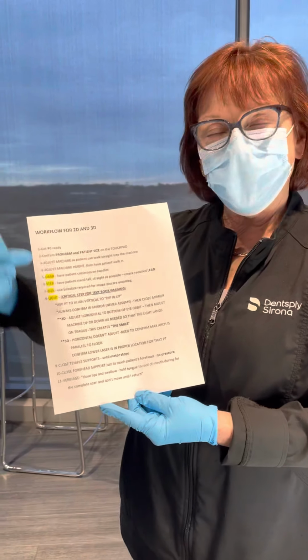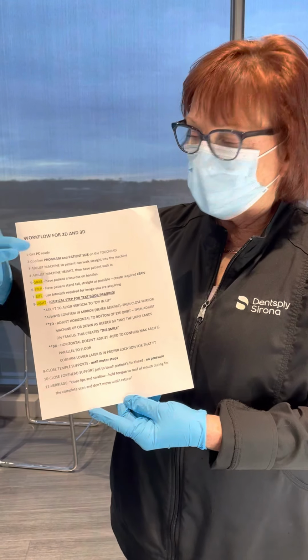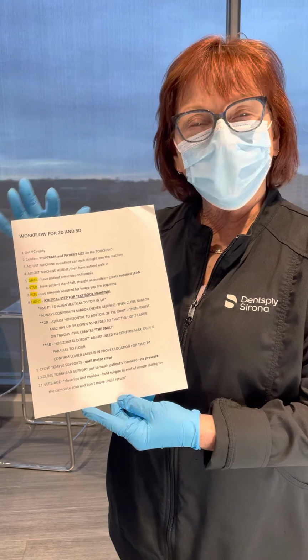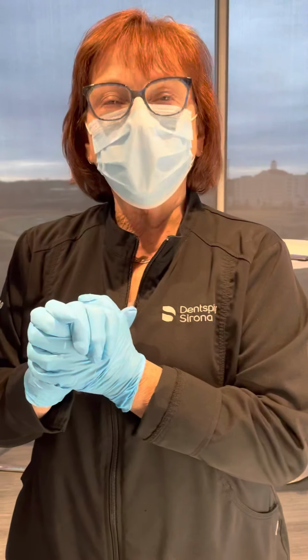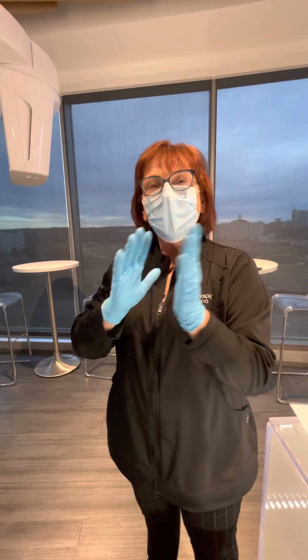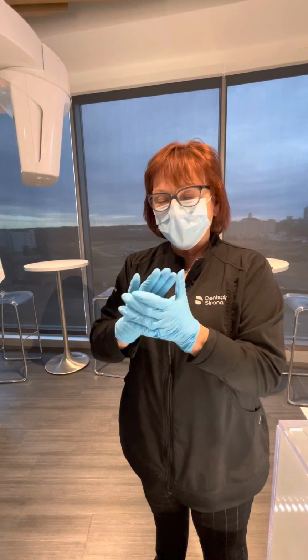Okay, so this is the handout that you already have in your possession, but we're going to go through this step by step, and this particular one is going to be for how to position for a 2D panoramic. Okay, so the very first thing I want you to always do is make sure you have your computer ready. We don't want to put the patient into the machine and have them stand and wait while we are addressing the computer. So have that ready to go.